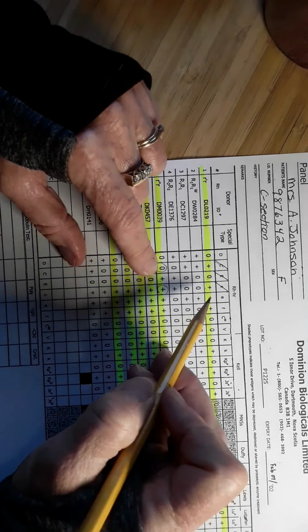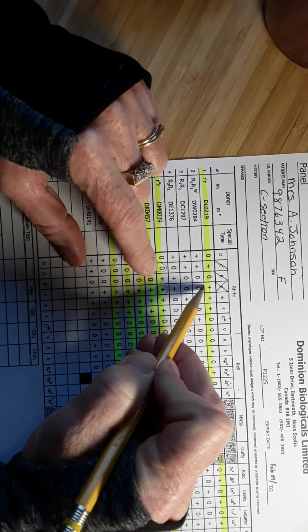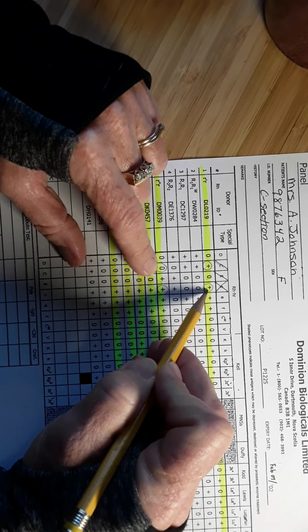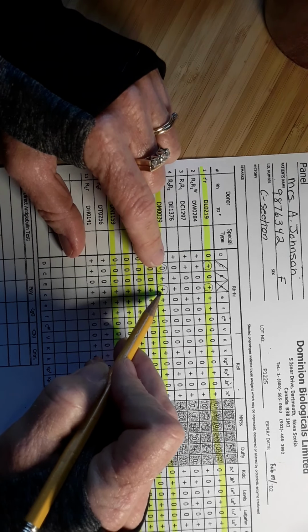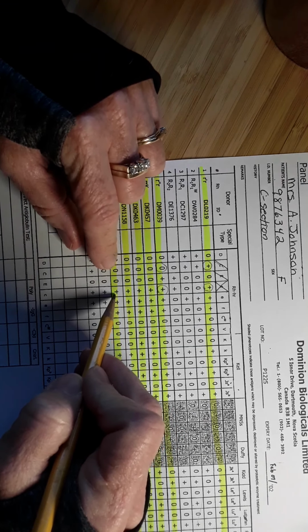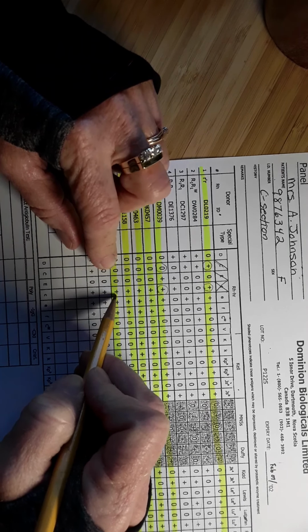So I am putting a second slash across little c. I found a heterozygous little c cell that did not react with the patient's plasma, and then I found a homozygous little c cell that did not react. And actually, there are many little c positive homozygous cells that did not react with the patient's plasma.